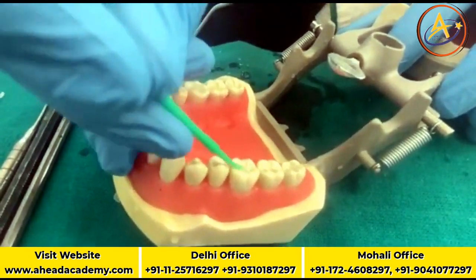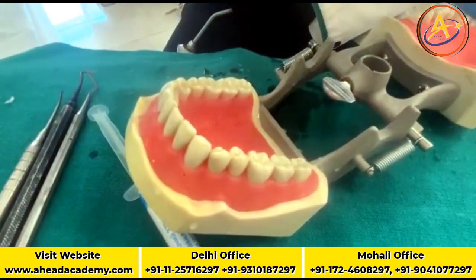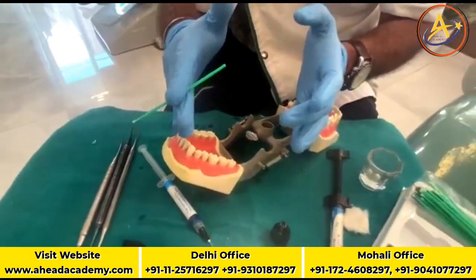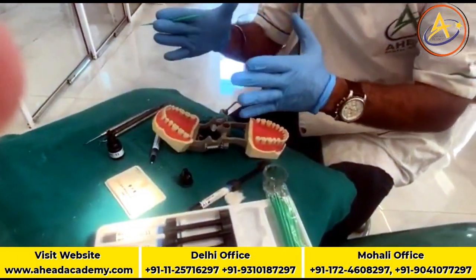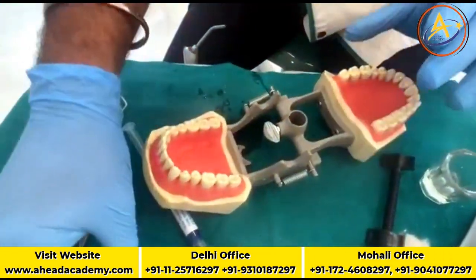And after massaging of the bonding agent for 20 to 30 seconds, leave the bonding agent for 1 minute. Do not cure it. I repeat, do not cure it. Leave the bonding agent for 1 minute so that the bonding agent can interact with the dentine. Now, I'll tell you one more thing.